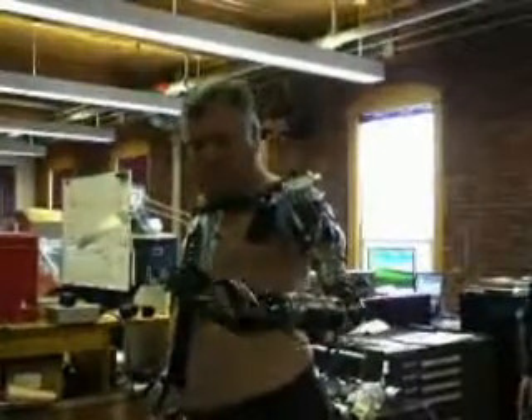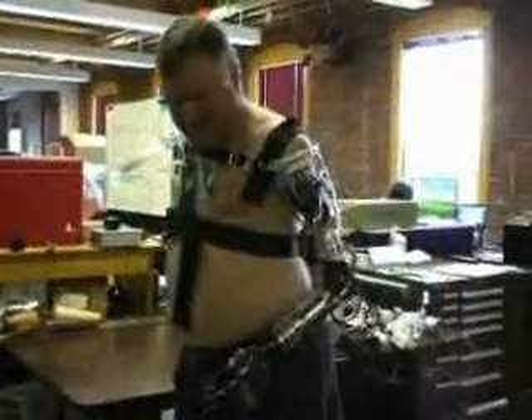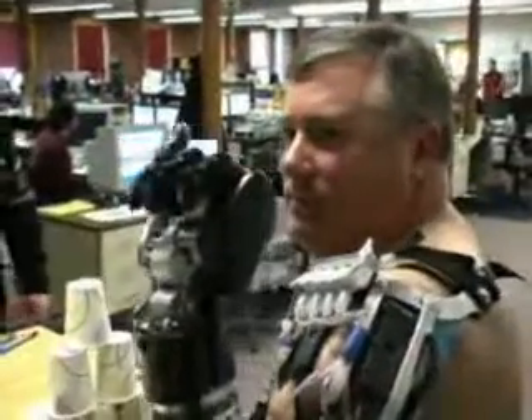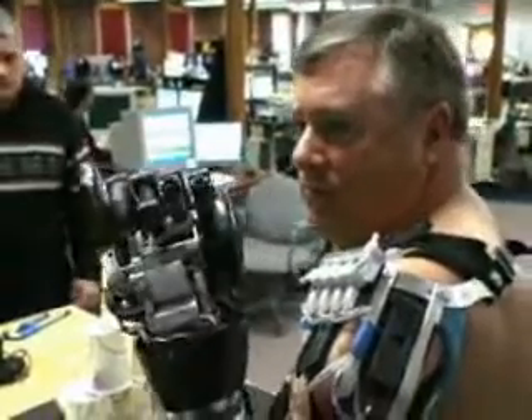She still has a short residuum. What does it feel like wearing that? It's kind of liberating. I've been without an arm for 26 years.